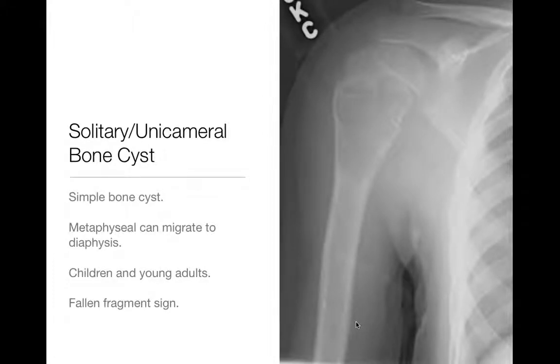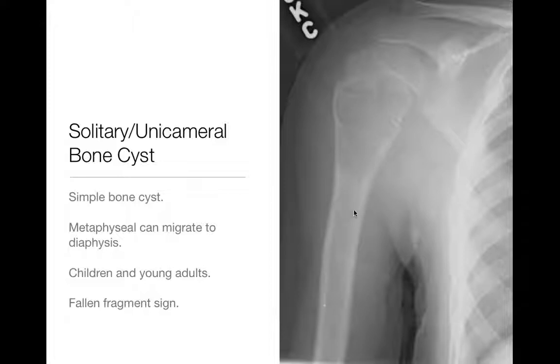Next, the solitary or unicameral bone cyst — a simple cyst filled with fluid. They originate around the metaphysis and can migrate into the diaphysis over time. You'll see these in children and young adults. Proximal humerus is a common location. Here's a child with a geographic lytic lesion in the metaphysis of the proximal humerus, with a pathological fracture and a fallen fragment sign — a piece of bone floating in the fluid-filled cyst. That fallen fragment sign is classic for unicameral bone cyst.